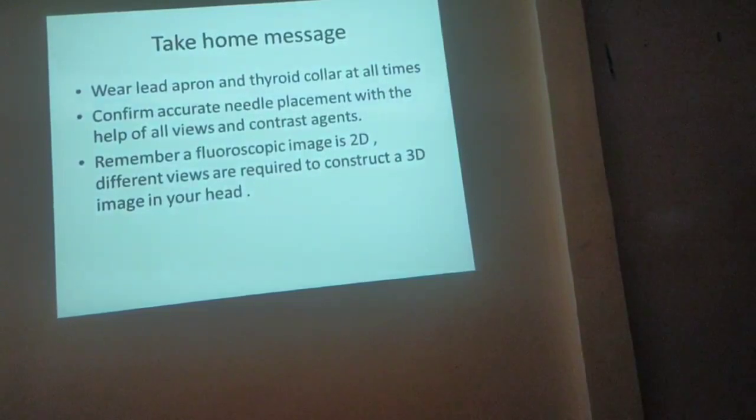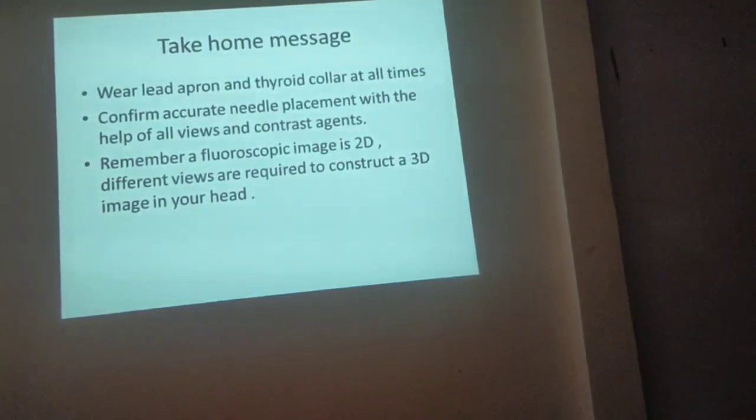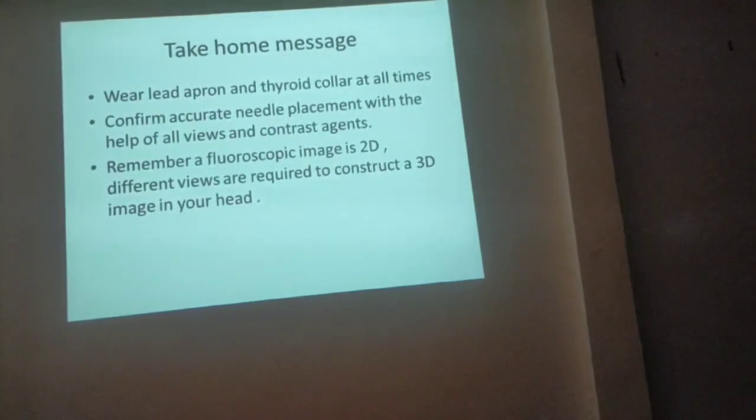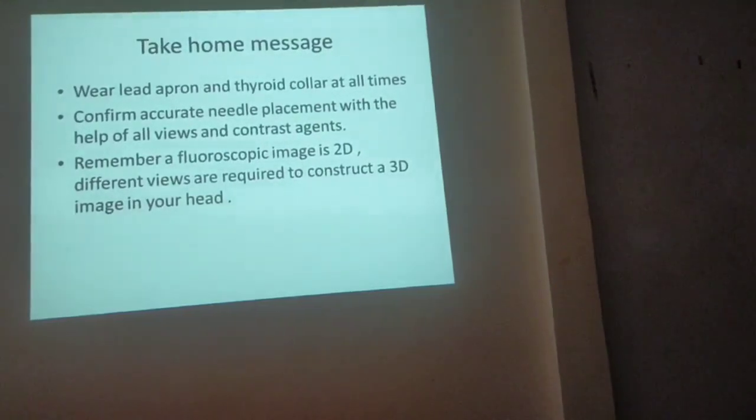Confirm accurate needle placement with the help of all views. Imagine that 3D figure in your mind, that will help you better. And always remember it is a 2D image, so different views are required. You cannot just go in one plane and do it. You have to confirm it with a lateral view.